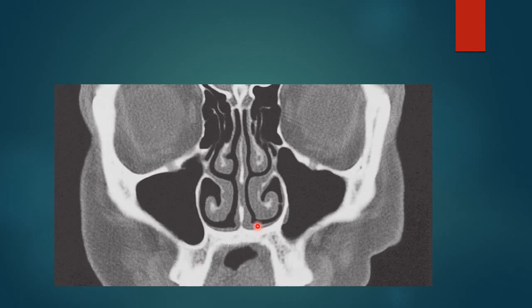This coronal CT image shows the nasal septum, inferior turbinate, middle turbinate, and the maxillary sinuses — right and left. As can be seen, the maxillary sinus appears pyramidal in shape, with its base formed by the lateral wall of the nose and its apex directed laterally into the zygomatic bone. The floor of the maxillary sinus is formed by the alveolar process of the maxilla, while its roof is formed by the inferior wall of the orbit.